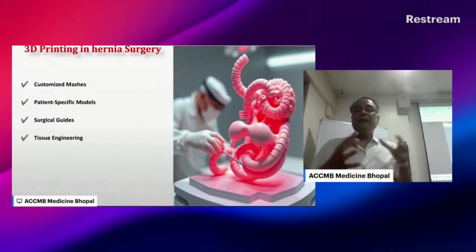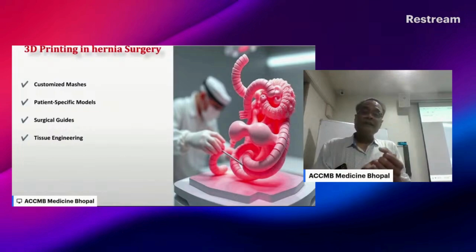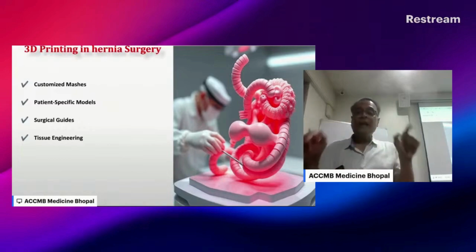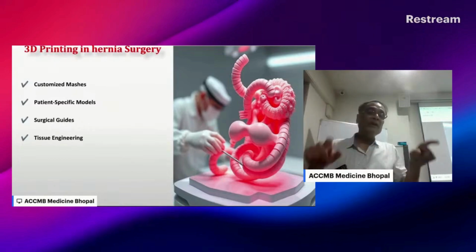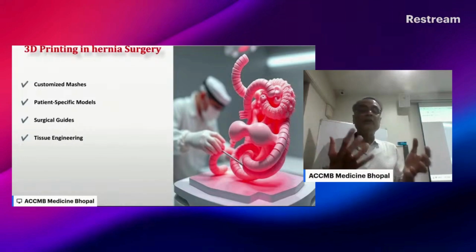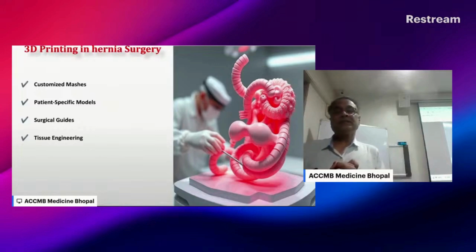Again, it will be a patient specific model, and 3D print technology gives us surgical guides, especially designed, which will take these meshes into the proper place. So this will help in important remodeling of the tissue, strengthening of the tissue, and it is a part of tissue engineering.